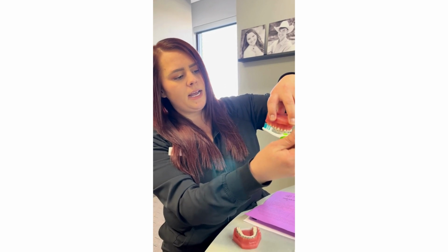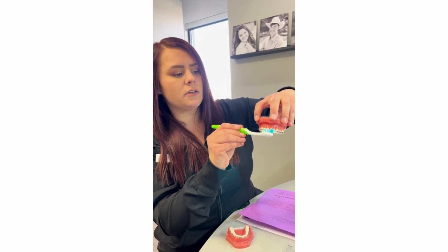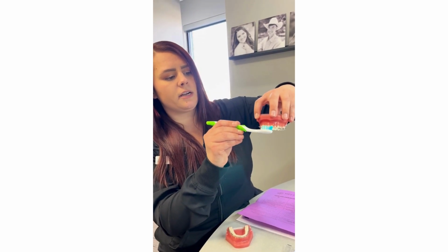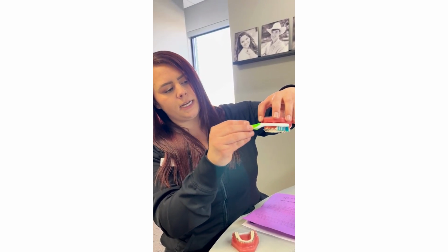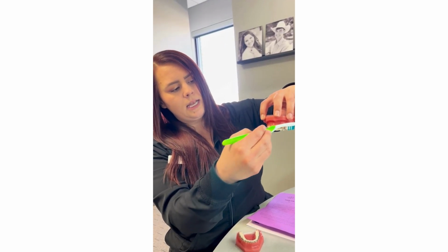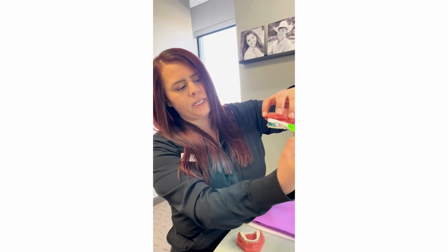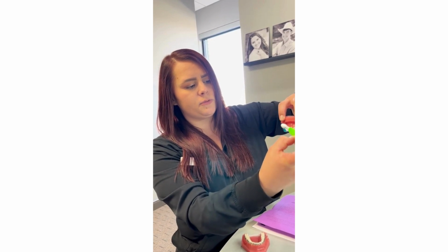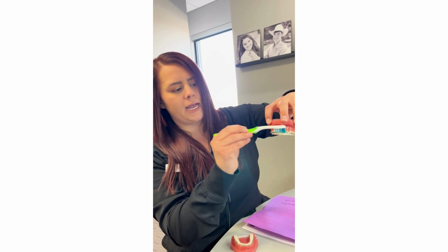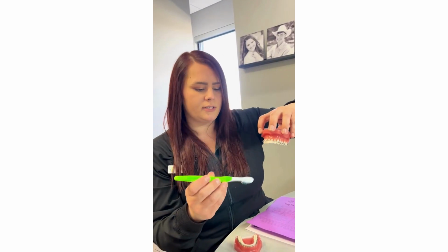Now, the number one angle that most people miss, and how they get those scars, is taking from here. You want to flip and go against your gum tissue down towards the brackets. This can be a nice gentle scrub. We don't want you going really, really hard. That can damage the tissues, but a nice gentle scrub will keep the tissues really healthy and it'll break up all the plaque on the top of the brackets to ensure that you're not getting those scars.